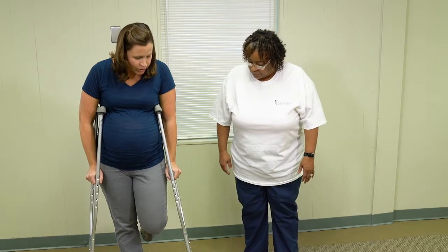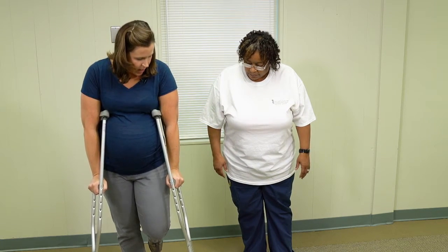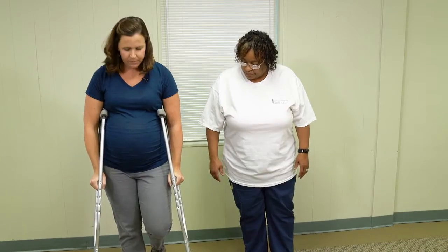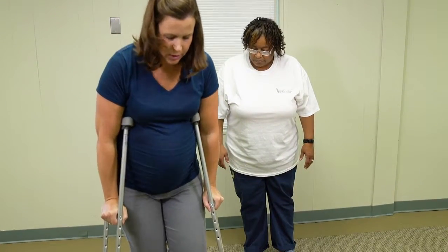Again, leg behind you or in front of you, crutches out in front of you. You're going to push through your arms, and when you're pushing through your arms, you should be squeezing between your arm and the side of your chest, your ribs. Okay, and you're going to push and hop, push and hop.